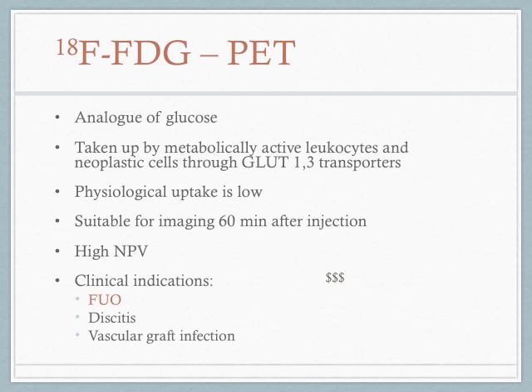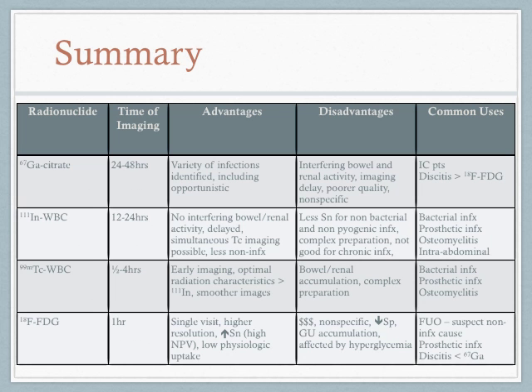It's suitable for imaging 60 minutes after injection. It has a high negative predictive value. It's indicated for FUO, discitis, and vascular graft infections. The problem with this is the cost. Leukocyte scans are much more cost effective.